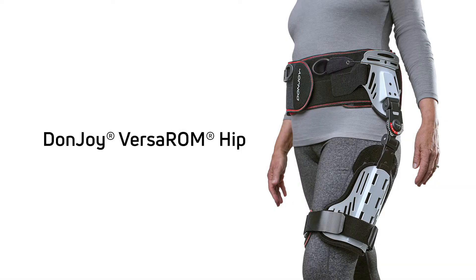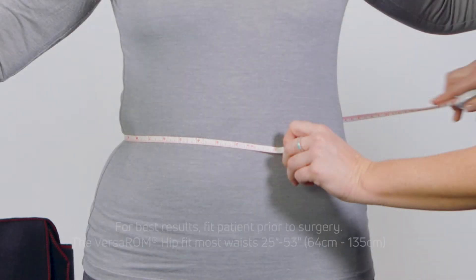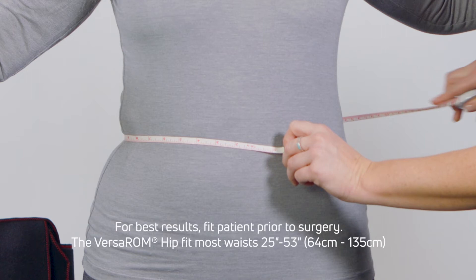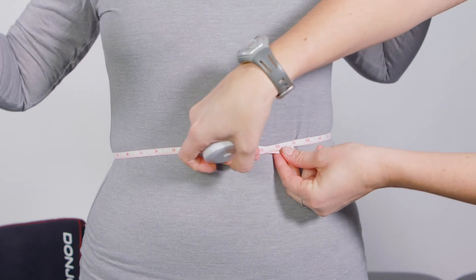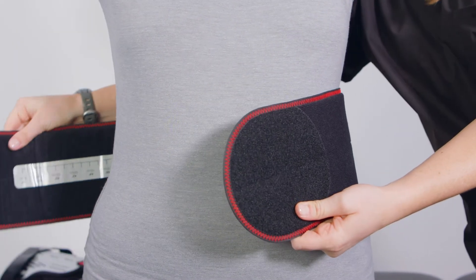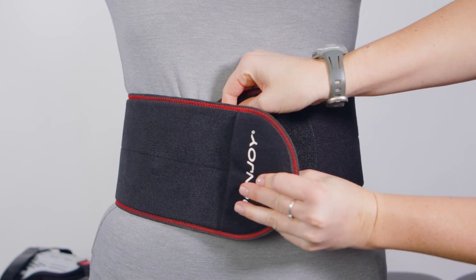This video will detail the application of the Donjoy VersaRum Hip Brace. For additional information, please refer to the instructions for use found in the packaging. The VersaRum Hip fits most waists 25 inches to 53 inches, or 64 centimeters to 135 centimeters. Measure the waist at the level of the navel. Align the edge of the rear belt component to a mark on the measurement strip corresponding to the waist measurement taken.